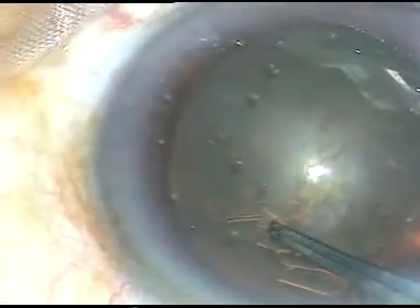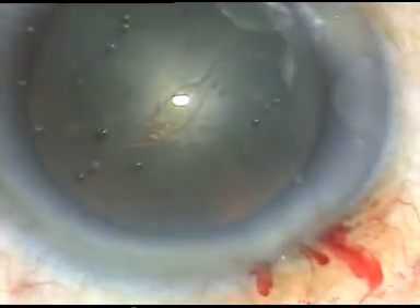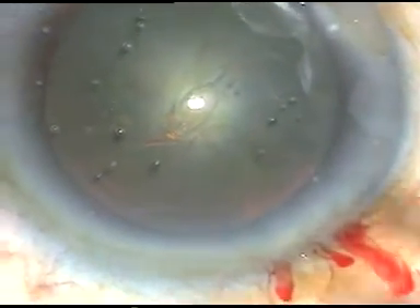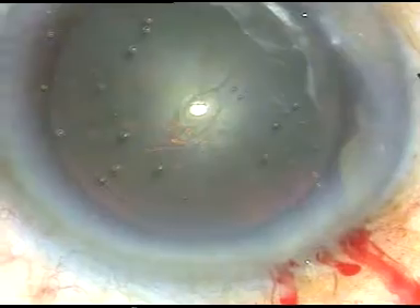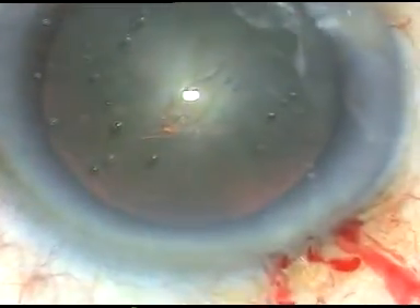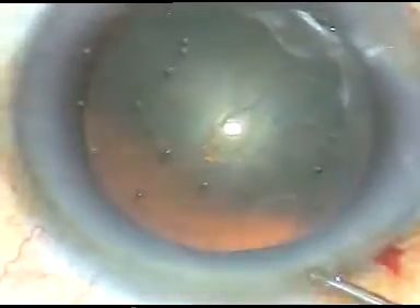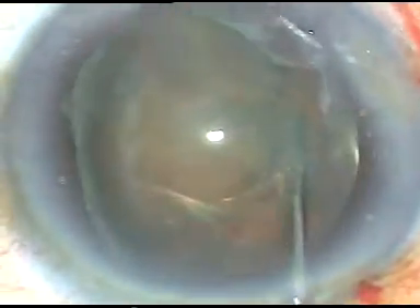When I do hydrodissection, the nucleus — one equator of the nucleus — prolapses out of the capsular bag. Here it is. The rexis has been done. As I am going to do hydrodissection, the equator on the left side will prolapse out of the nucleus. I just tap on the opposite equator and it will prolapse further. Hydrodissection: the equator on the left side has prolapsed out of the capsular bag. Tap on the right side, it prolapses further.